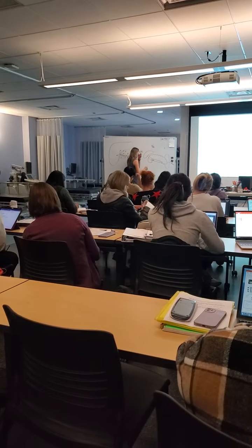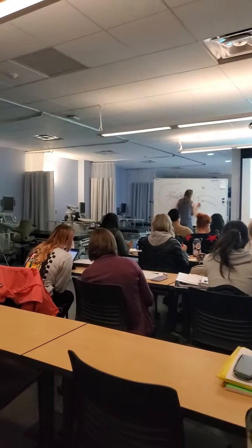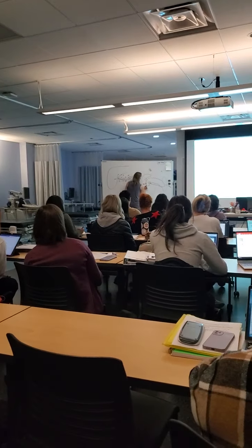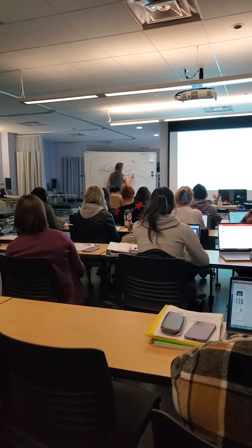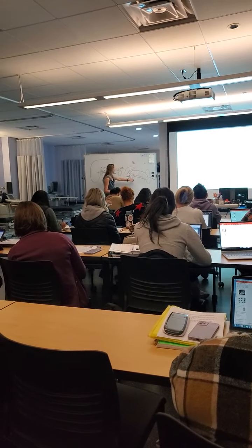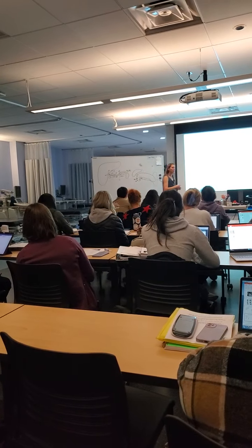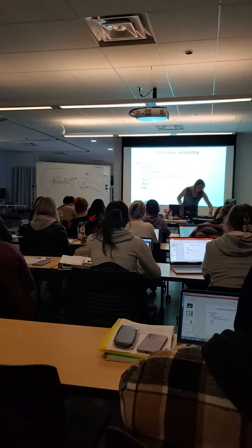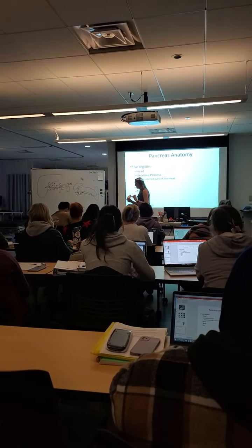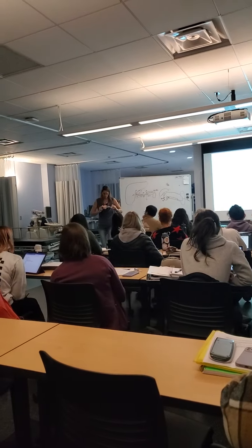So we have 5 regions. We have the head, which is kind of the very front here, and that's where the CBD and the GDA are. Then we have what's called the uncinate process. So it's considered part of the head, but it's the part that kind of hooks under our main portal vein. It's like behind. Kind of. It's not really behind, it's posterior. But he hooks around the main portal vein.